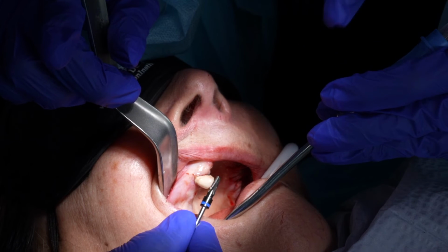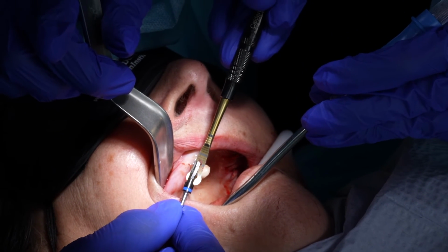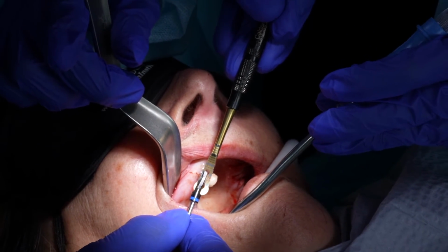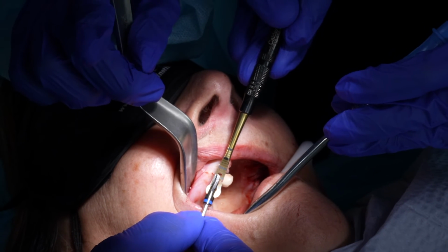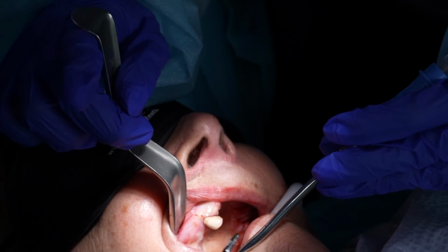So if we have a step drill here and we don't know what size this step drill is, we put it right here against right away and we know it's a 10 millimeter implant. I mean drill, step drill, okay? Or 11.5. So that's how we can determine that.